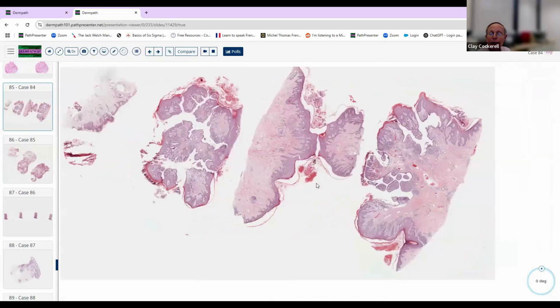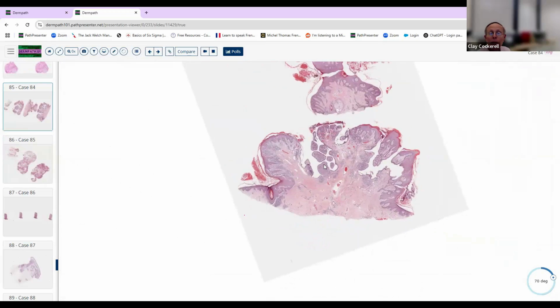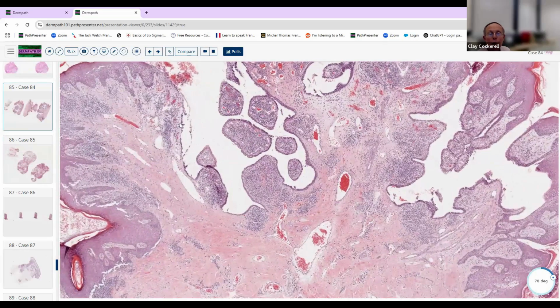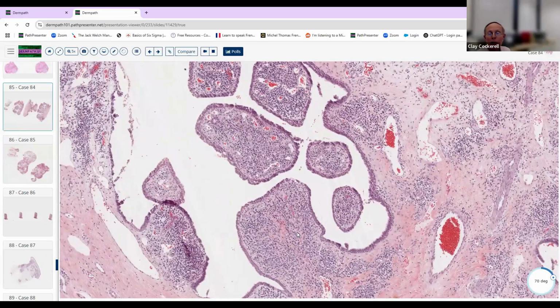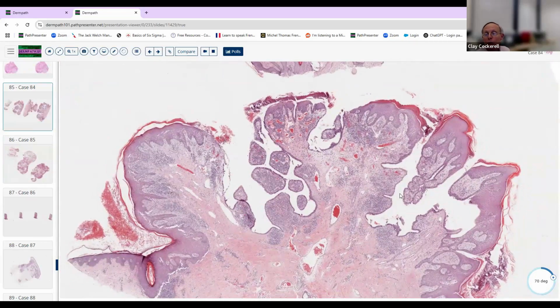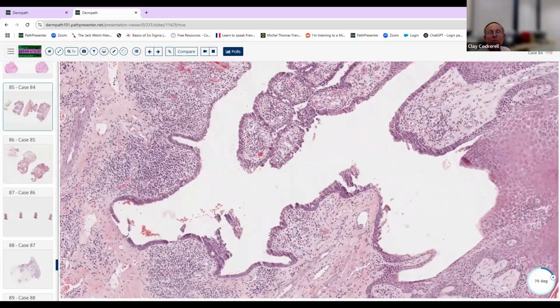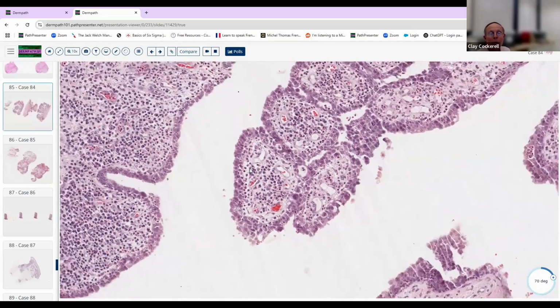Here we've got the same type of lesion that's contiguous with the epidermis that we saw, the hidradenoma papilliferum. This is syringocystadenoma papilliferum. These are often associated with nevus sebaceous. They don't have to be. The other poroid lesion, by the way, is dermal duct tumor. I failed to mention before. So we've got this syringocystadenoma papilliferum.